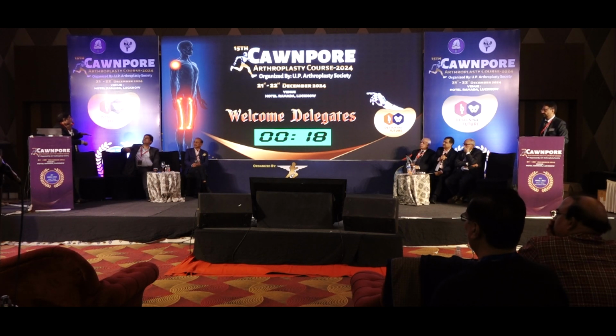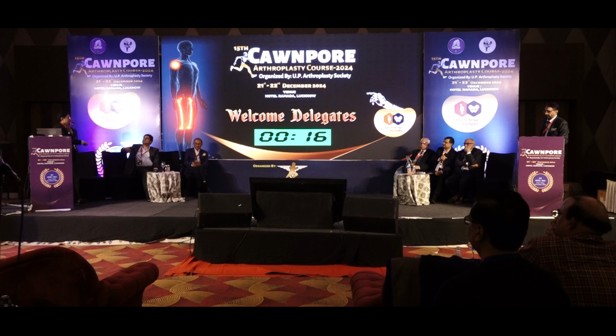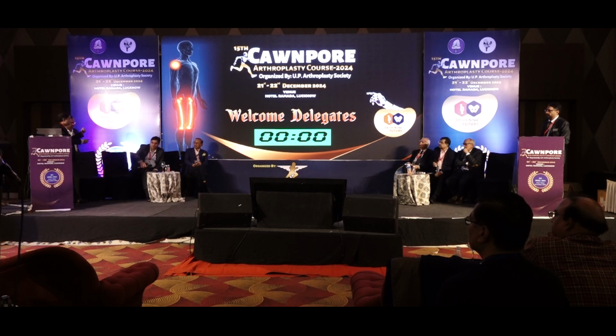Personally, I've never had to convert an Attune CR to a PS as yet. And we use all systems. It's not like I use only one system. My practice is 10% of everything. And in other systems, there are instances when I had to convert to a PS, but with Attune, never. So you should know what system you are using, what is the capability of your insert. So I think skill improves with time.